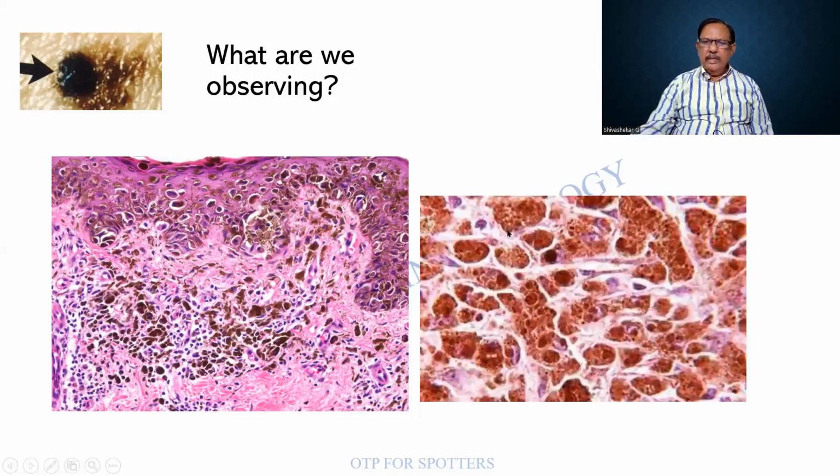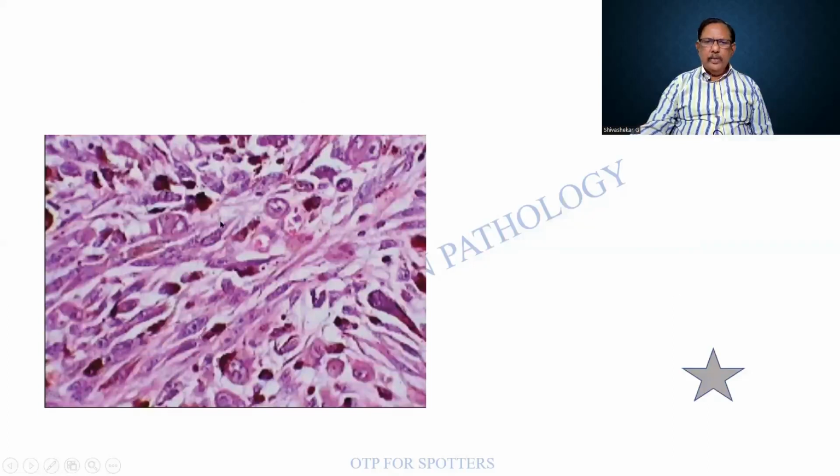This is another slide that is showing coarse granules which are obscuring the nucleus. So this is the intervening supporting tissue. Large cells, coarse granules, nucleus obscured. Look at this one. I am finding round cells. There is a prominent eosinophilic nucleolus. Also, there are elongated cells. Both of them are tumor cells, and I am finding the brown-black pigment.